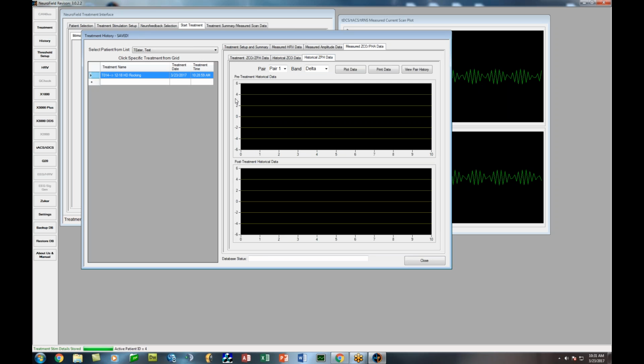So there's a lot that went into the history this time that we're really happy with, and we're building on this. It's our intention to build a thinking machine. We definitely want to acquire as much EEG data as possible and to start to formulate profiles. So there's more to that.